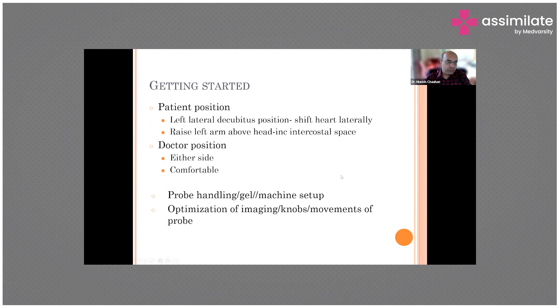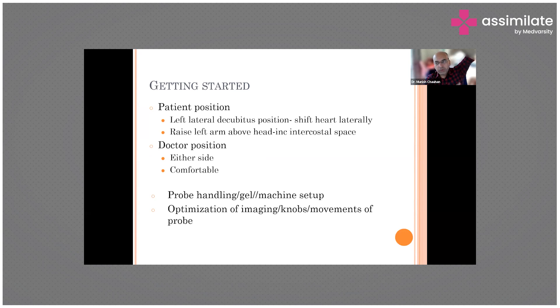Before we start, we need to ensure a few things. If possible, if the patient is conscious and cooperative — or even if unconscious — we prefer them in the left lateral decubitus position so that the heart becomes closer to the probe for a better image. You can raise the left arm above the head to increase the spaces between the ribs, because you basically want bigger intercostal spaces so the probe can fit in between the two ribs. Doctors usually prefer to sit on the right side, but in the ICU you may need to sit on the left side depending on equipment placement.